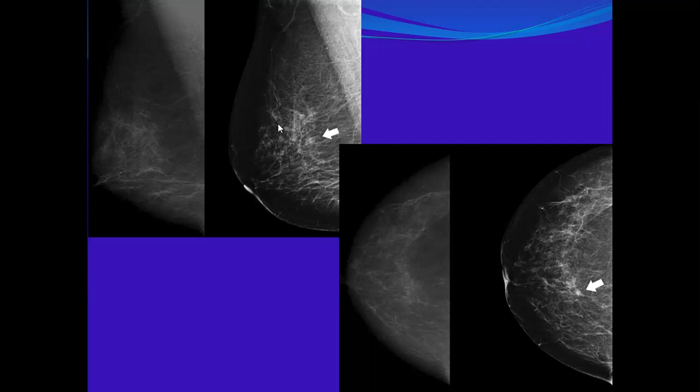So you have two mediolateral and two CC views. For the first one, there is no abnormality that can be detected. In the other one, there is a small lesion, could be in the central or inner border of the right breast. This is considered a developing asymmetry. Excellent, well done. It is considered a developing asymmetry. So what is next? I can see the patient after 3 months as BI-RADS 3, or do a compression view.